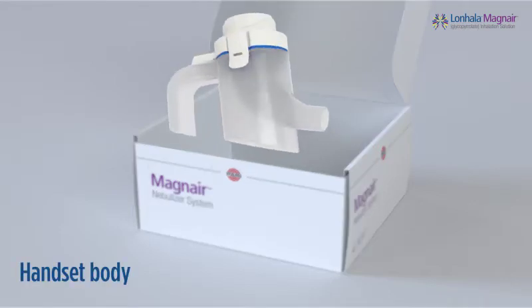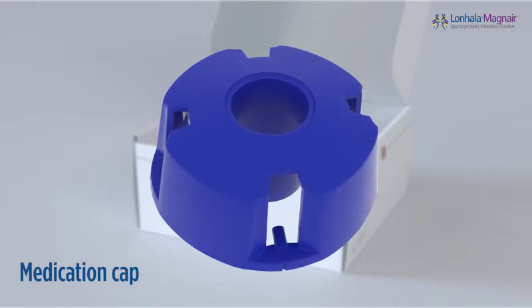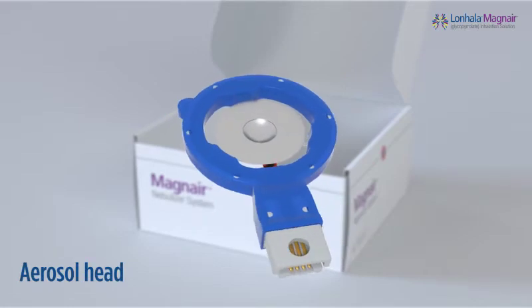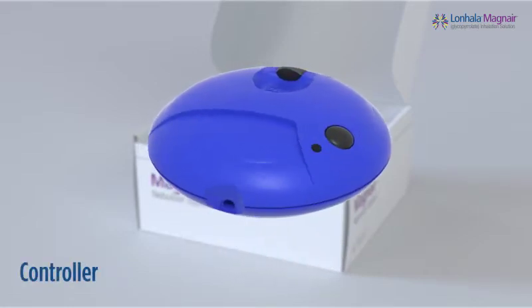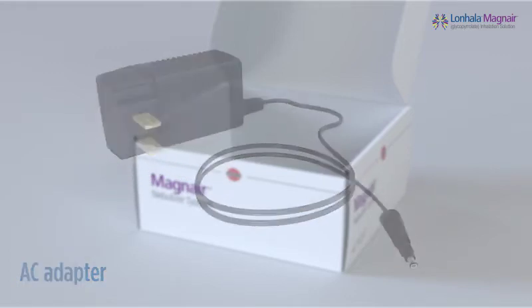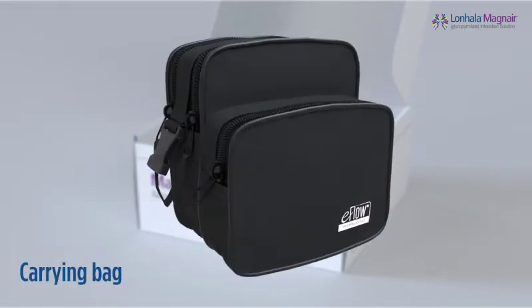Magnair includes the handset body, medication cap, mouthpiece, aerosol head, controller, connection cord, AC adapter, four AA batteries, and carrying bag.